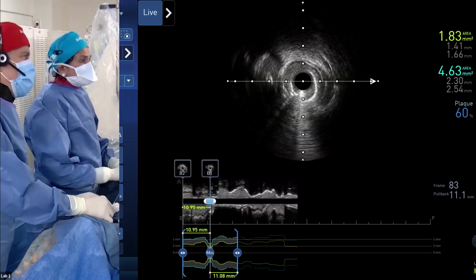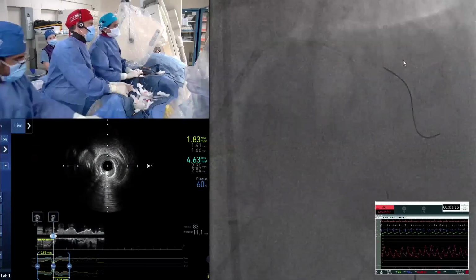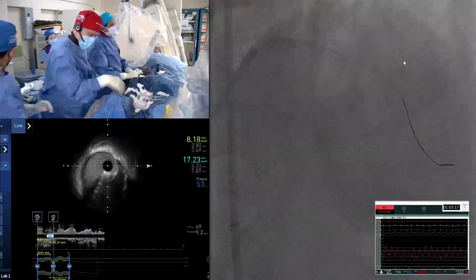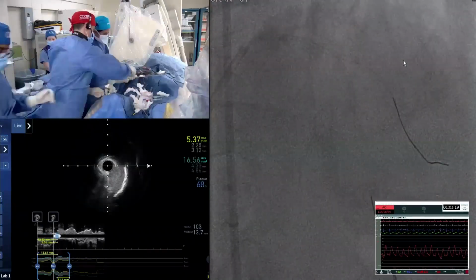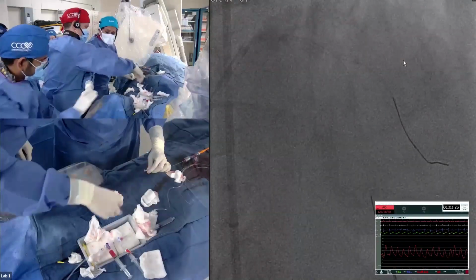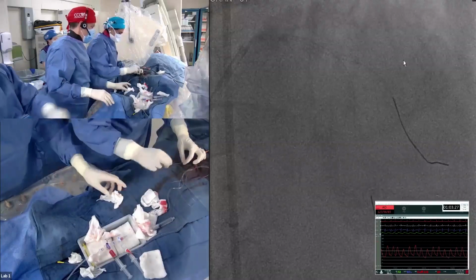You actually can go the other way. It can go both ways, and the branch can shut down. But this is where secondarily imaging is helpful, because you couldn't pass the imaging catheter. You know you need to do something else. Yeah, for sure. Once I saw the imaging catheter wouldn't cross, I would just rota the diag, but let's see what's going on.